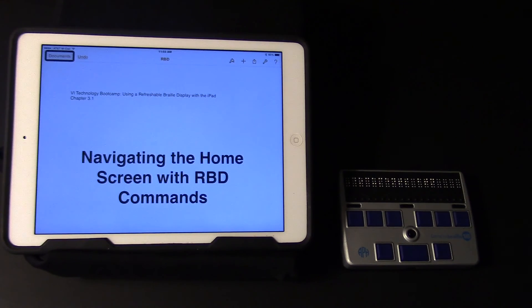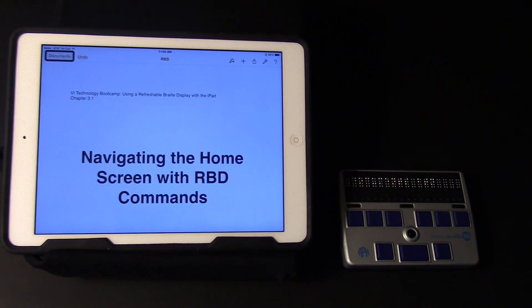This video demonstrates how to navigate the home screen using gestures and refreshable braille display commands.